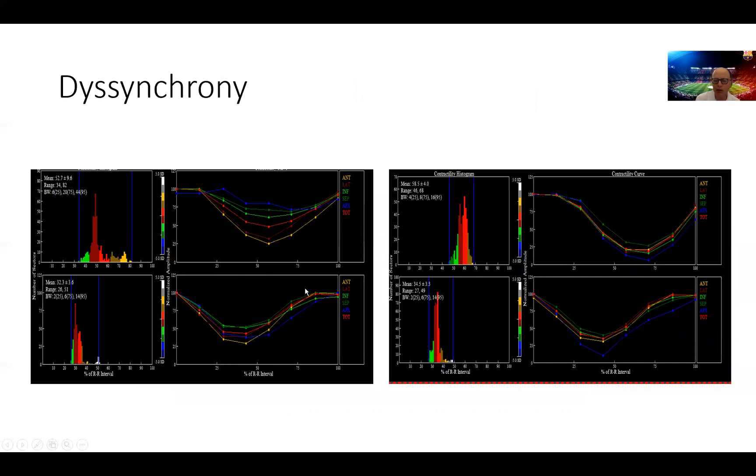And one more important observation on this study is this is the patient synchrony analysis at rest where we can see this is a very synchronous ventricle. All the segments are contracting almost at the same time. Post stress we can see this widening of the histogram here and we can see the patient or the segments become dyssynchronous.